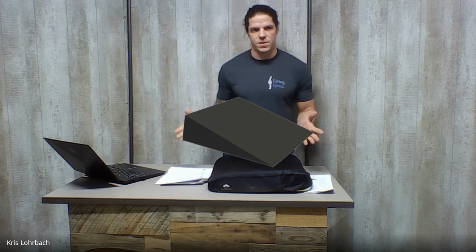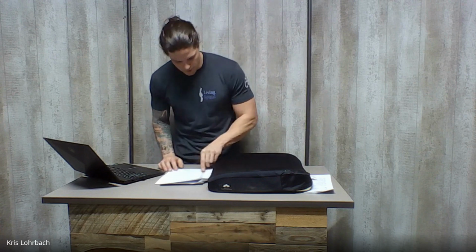The next one is wedge. A wedge is something that you don't see too often because all it really does is affect the dump of the seat. So it raises the front, lowers the rear. And most people are able to do that by adjusting their wheelchair. So some people prefer a wedge cushion, but it is a less common postural support. Most people adjust the chair so that the cushion is just right.